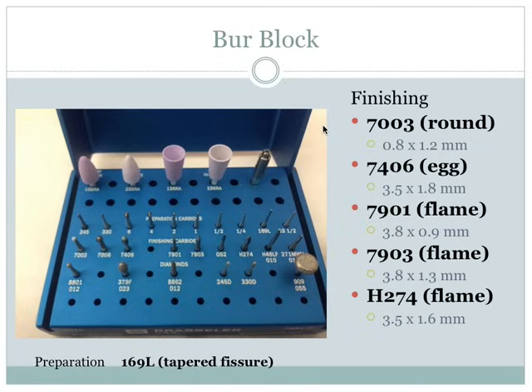Finishing burrs are a little bit different in that they have more blades. So the cutting burrs may have 6 blades, whereas a finishing burr might have 12 blades, which means it won't cut as easily. It'll be a more gentle cutting of enamel and dentin.